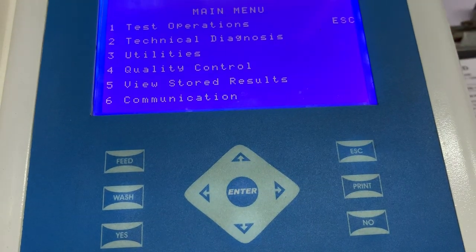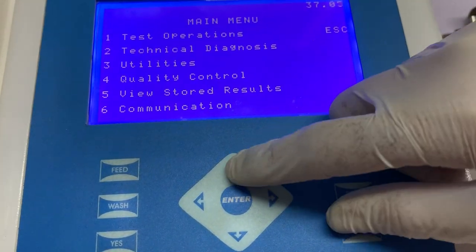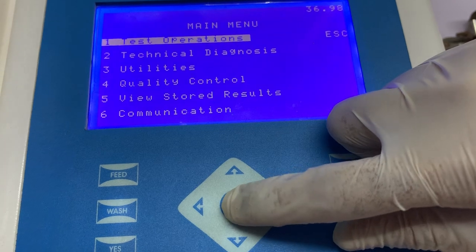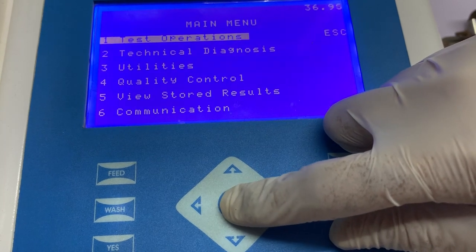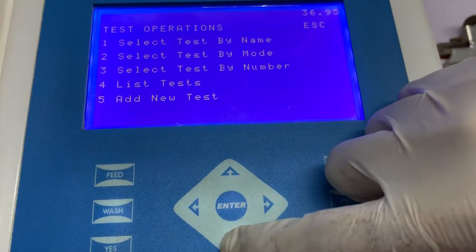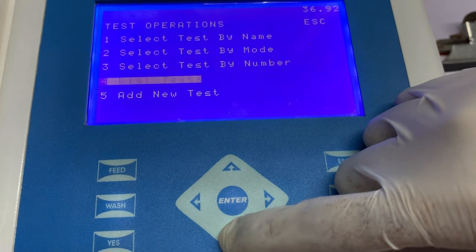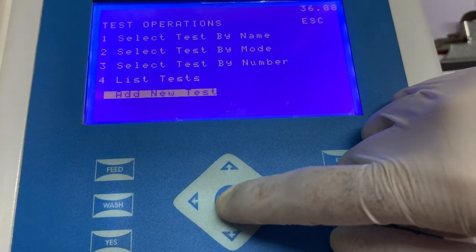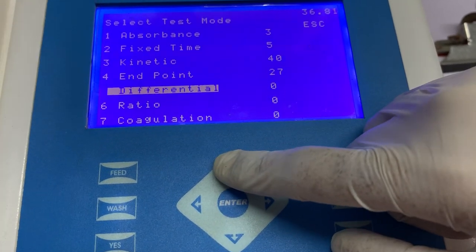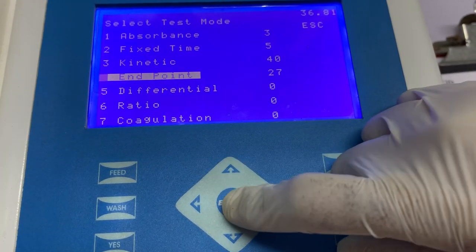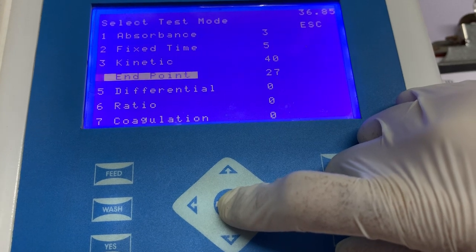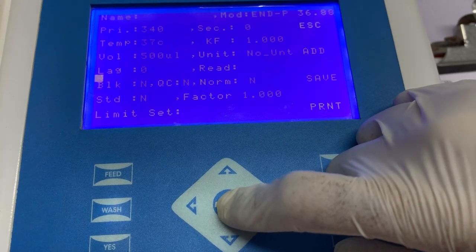The first thing we need to do is switch on the instrument and come to the main menu. Once we are at the main menu, select test operations and then select add new test. Here there are multiple options available, in which we have to select endpoint because uric acid is an endpoint parameter.